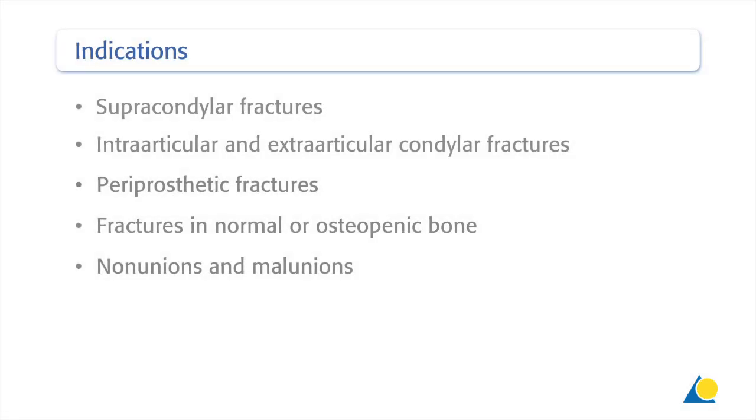The variable angle LCP curved condylar plate system is indicated for multifragmentary distal femur fractures, including supracondylar fractures, intraarticular and extraarticular condylar fractures, periprosthetic fractures, fractures in normal or osteopenic bone, and non-unions and malunions.